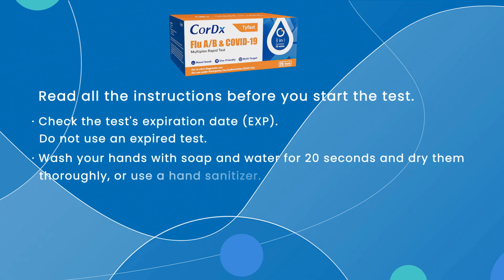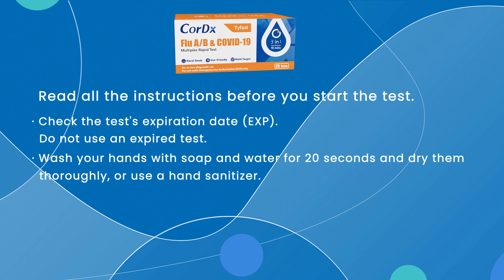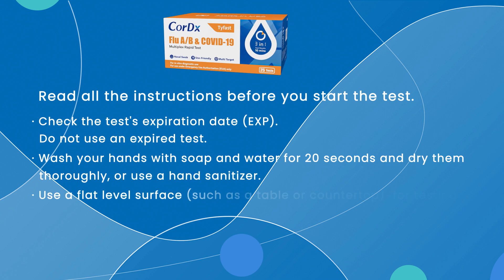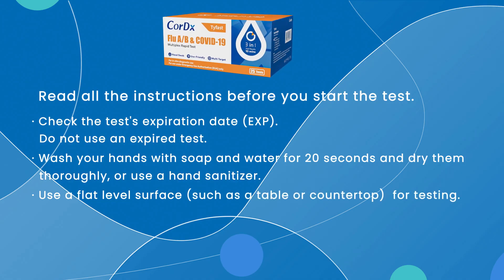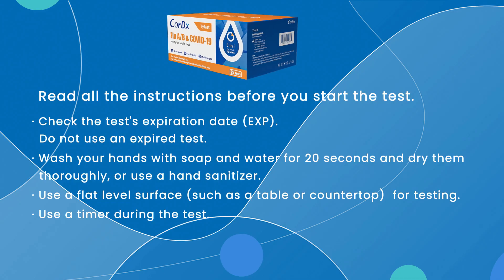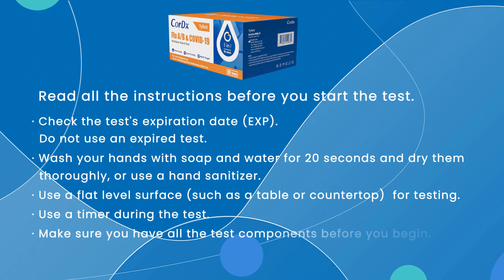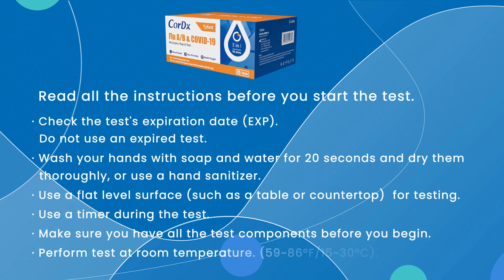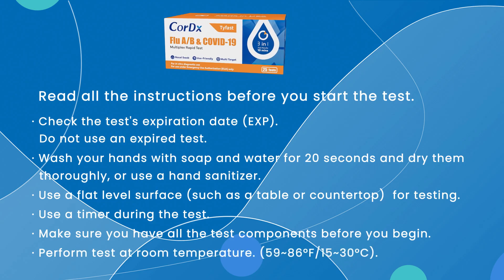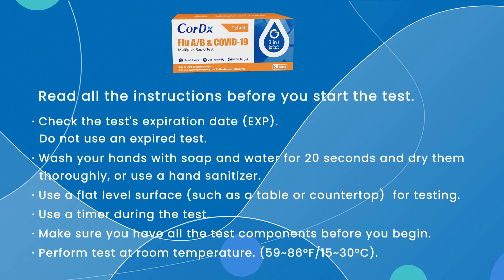Wash your hands with soap and water for 20 seconds and dry them thoroughly, or use a hand sanitizer. Use a flat level surface, such as a table or countertop, for testing. Have a timer ready to use during the test and make sure you have all the test components before you start. Perform the test at room temperature, between 59 and 86 degrees Fahrenheit, or 15 to 30 degrees Celsius.